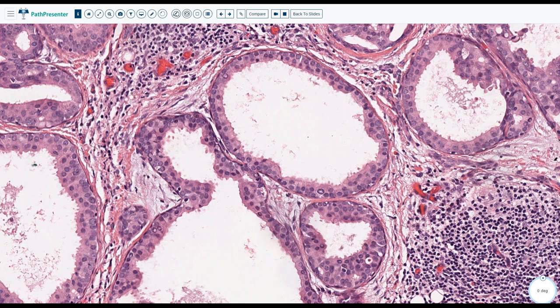They like to actually discuss more the immune stains. Immune stains, anybody? What are the immune stains you would order? Number one, yes, it is androgen receptor positive. Almost always androgen receptor positive. The other immune stains, you can do CK7, and GATA3. Yes, I agree, GATA3, not GAGA.